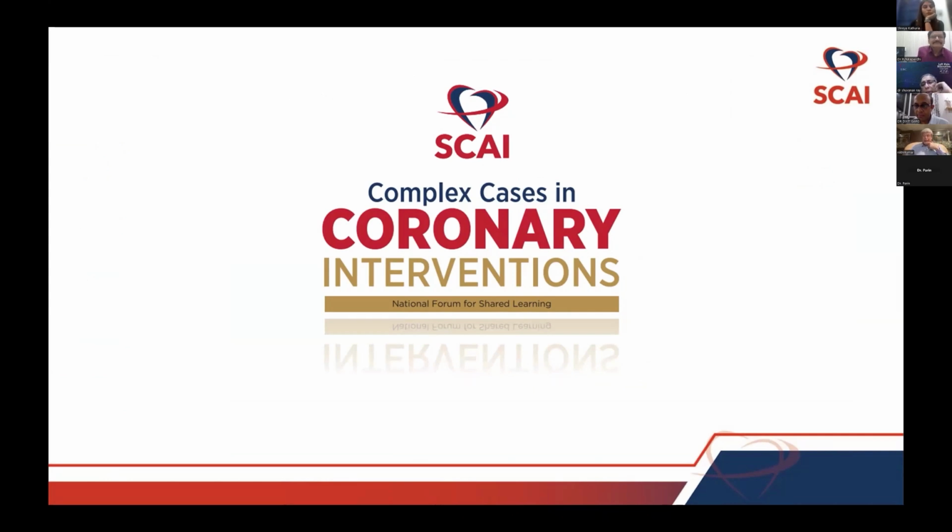But every good intervention needs a little bit of luck, because in a true CTO, particularly at the ostium, where the angle is around 90 degrees, it is very amazing for a Fielder XT with a blunt tip to cross.